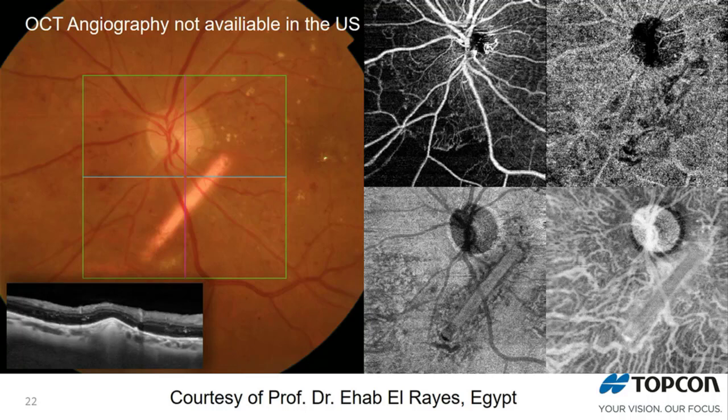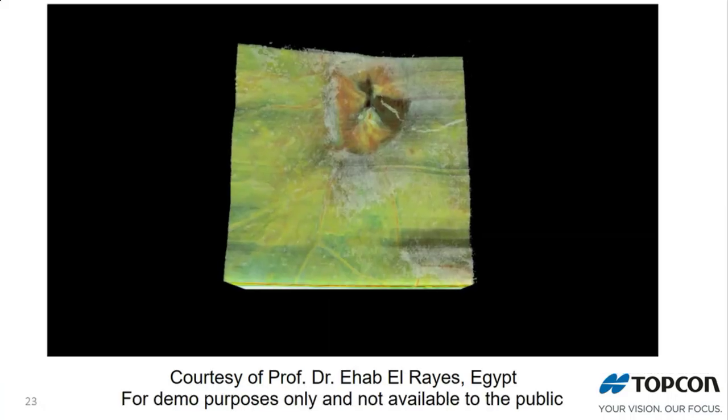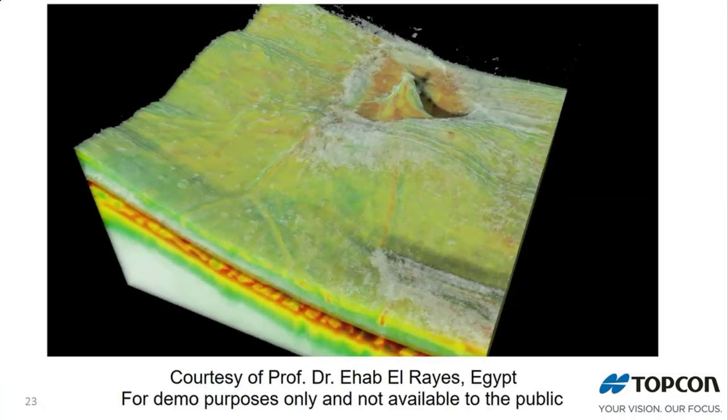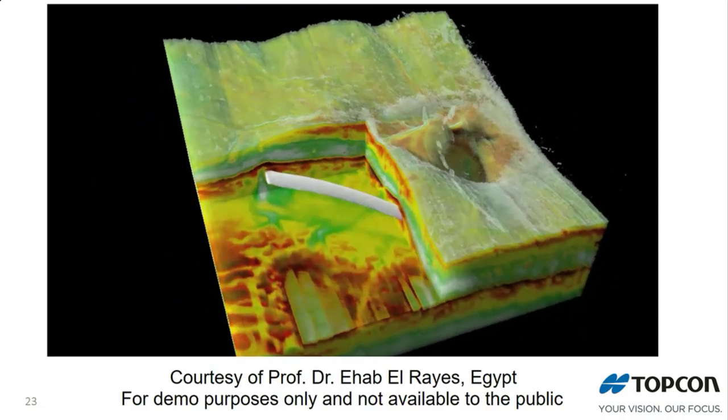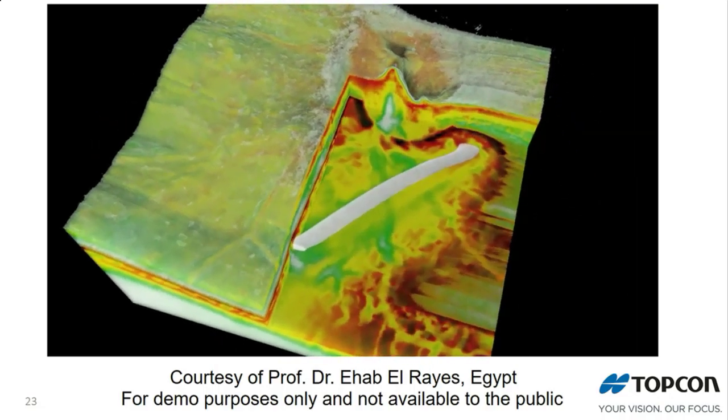Now the idea of that, it seems to be working very well, but he wanted me to visualize it, so I did an OCTA, and as you can see here, you can see the ischemic areas, you can see some of the microaneurysms, but in something I call the choroidal vasculography, which I will discuss later, you can see the exact placement of the device inside the choroid. So you can also, of course, visualize that three-dimensionally with my program. Again, I do this just to show the details, but all of this information was captured using the OCT.